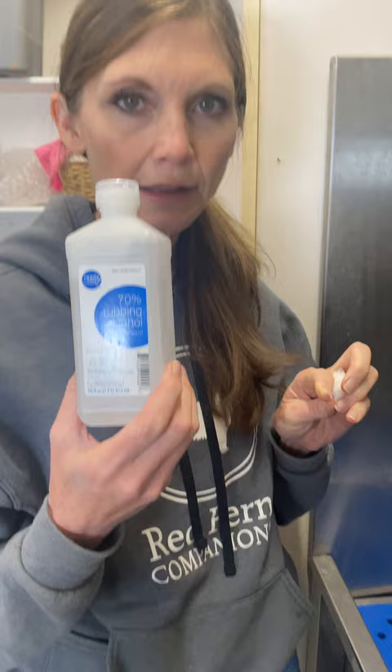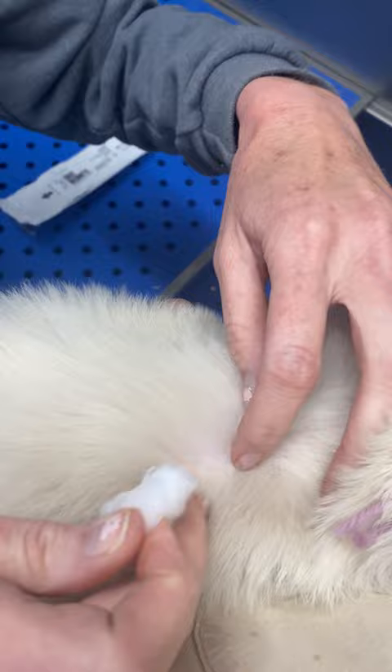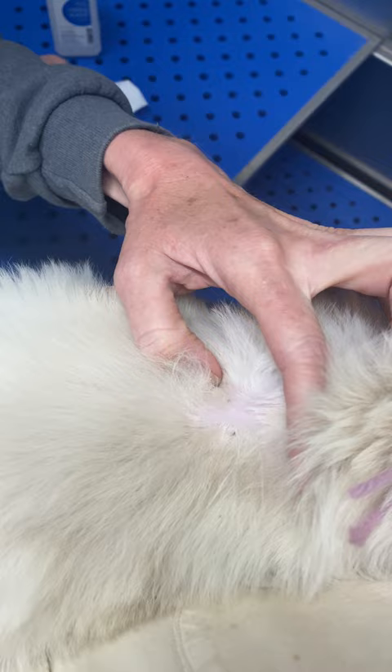So we are going to get your cotton ball covered in alcohol. We put them right in between the shoulder blades, so you're going to find the shoulder blade area. Open that up and just clean it good with the alcohol. You'll want to make sure that you let it dry a little bit, because it stings if you put it in before. So I just get that wet and then I get out my supplies.